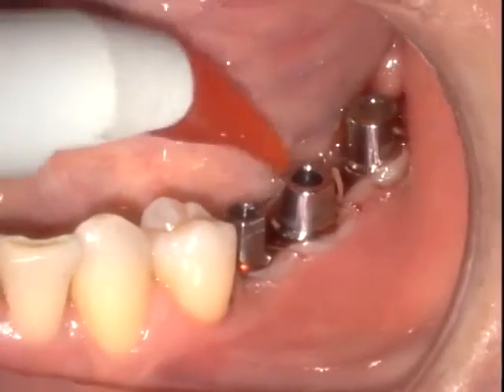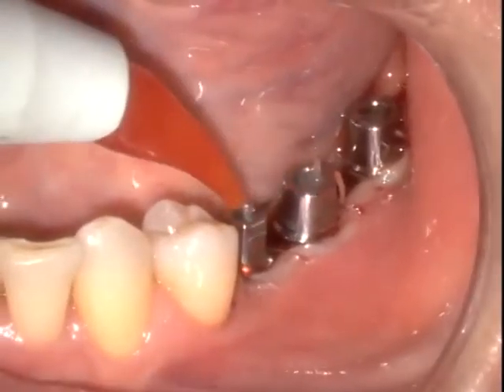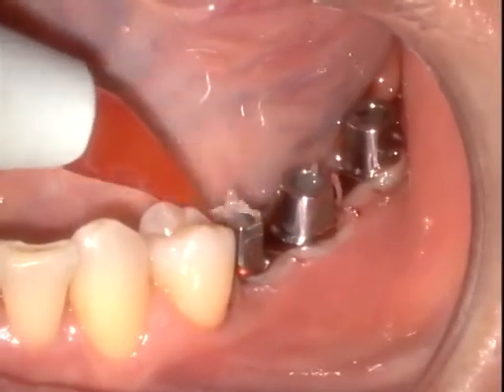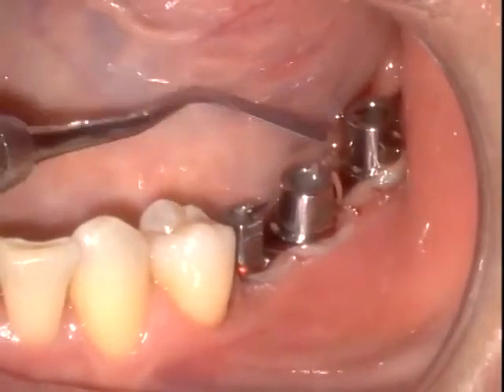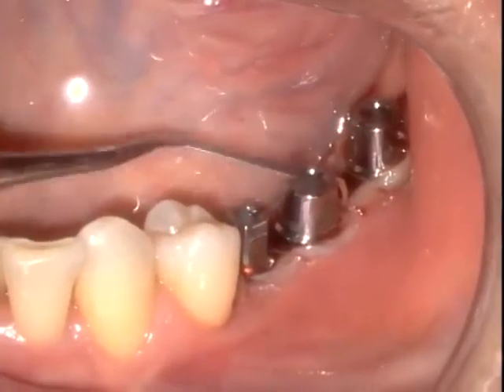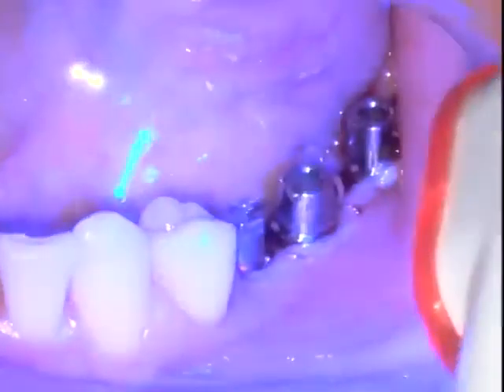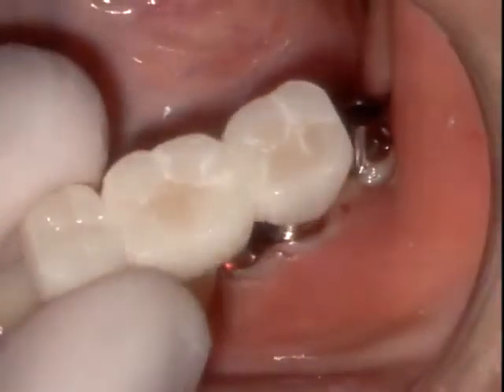It's always very important that if you're going to cement the case, that you seal the screw access channels. We do this either with silicone material, or we can also use barricade, which is being utilized here. This is a light-cured periodontal dressing, and we simply secure that. It's easy to place and easy to remove.